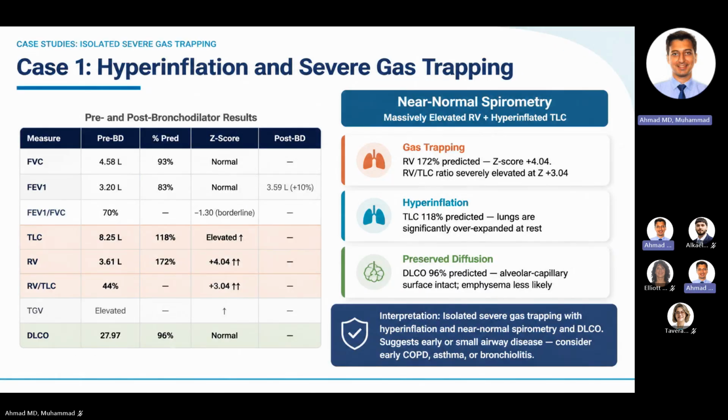Yes. On the pulmonary function test, sometimes it says predicted value and measured or actual value, and they are different. Which one do we use? The measured value. The predicted value is what they should be for age, sex, height, and race. The measured value is what they actually are. So we use the measured value, and the z-score reflects the measured value in comparison to the predicted value.